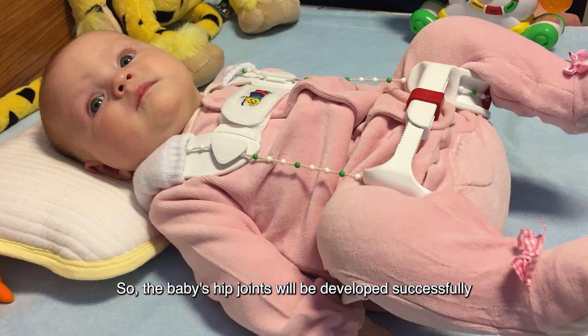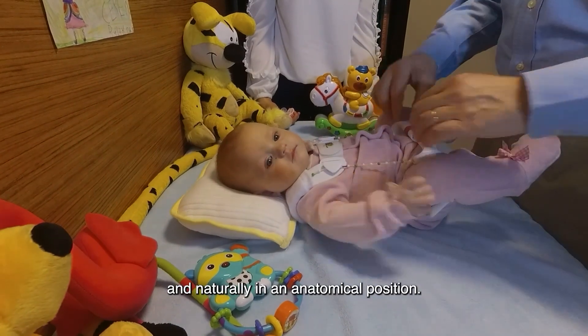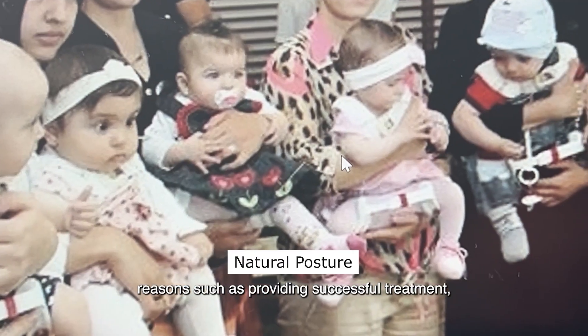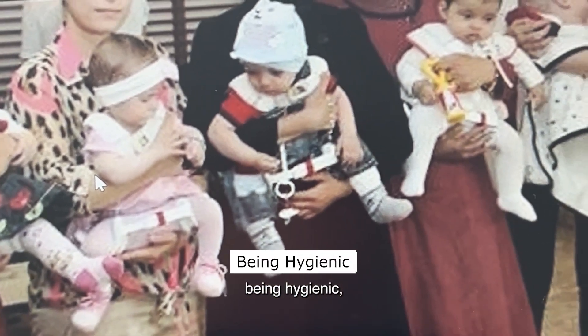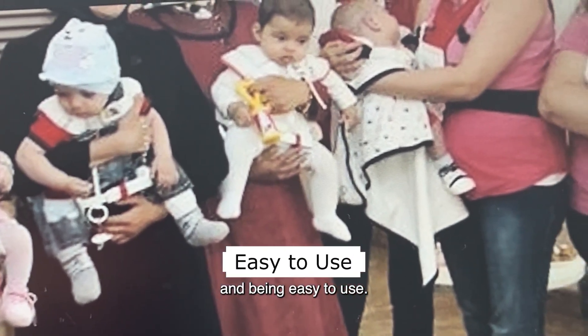The baby's hip joints will be developed successfully and naturally in an anatomical position. The tubing and hip orthosis is preferred for reasons such as providing successful treatment, being light and thin, being hygienic, being effective, and being easy to use.